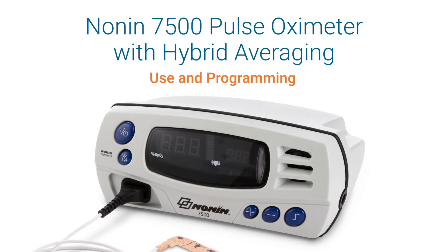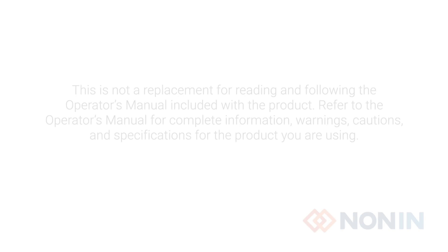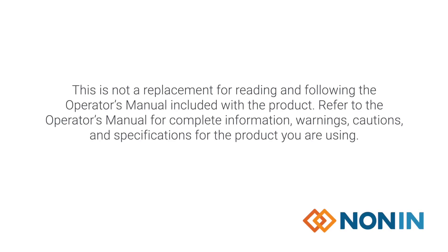This short video shows how to properly program, connect, and operate the Nonin model 7500 pulse oximeter with hybrid averaging. Please be sure to read the operator's manual for your Nonin product in addition to watching this video.